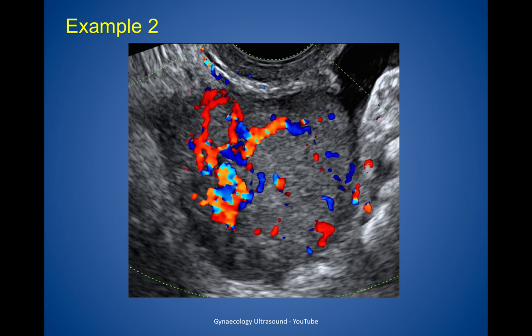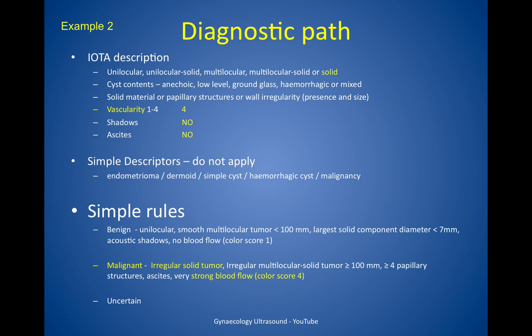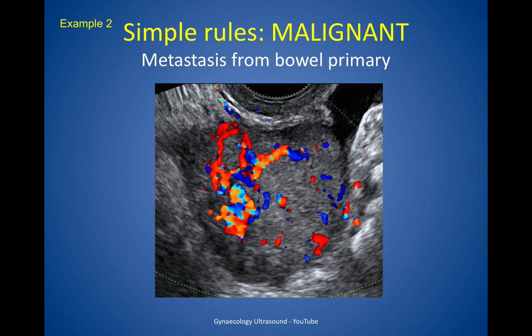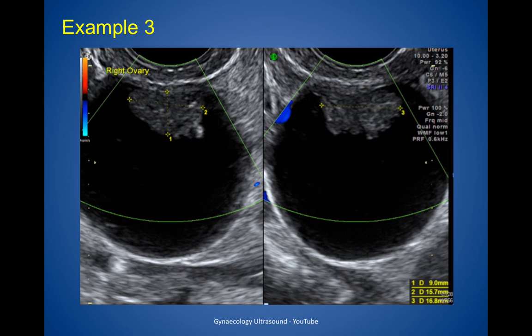Here's another example. On IOTA description it's a solid lesion with strong vascularity, no shadowing, no ascites. The simple descriptors do not apply. On simple rules it's malignant because it's an irregular solid lesion with strong blood flow. There were no benign features so it must be malignant, and it was — it was a metastasis from a bowel primary.